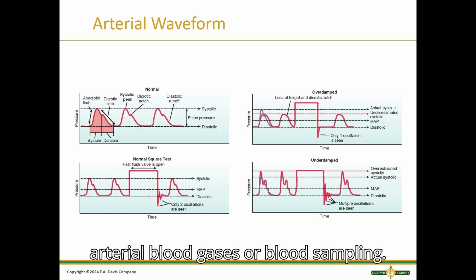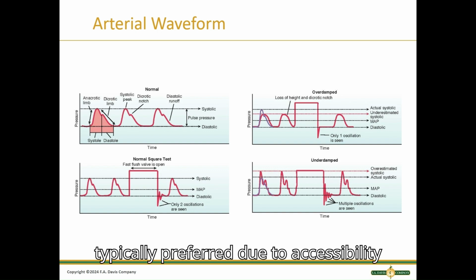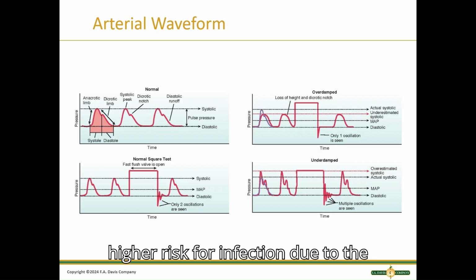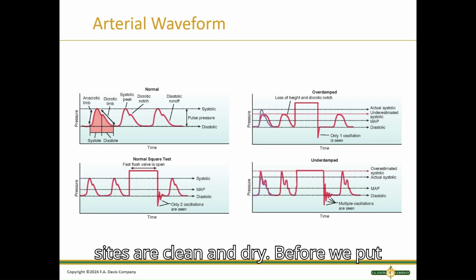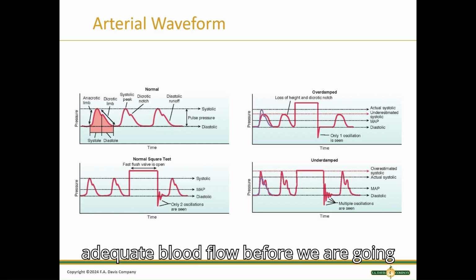So we're going to start looking at catheter occlusion. Is it kinked? Is there a clot? Is there air in the tubing? We're going to make sure that our pressure bag is inflated, that our transducer is level and possibly re-zeroed. We're going to look at our pressure cables, make sure that they have good connections. And we might need to zero it back to the atmospheric pressure. We will talk about this during our labs and show you a little more on how to do this on the person at the bedside with the monitors.